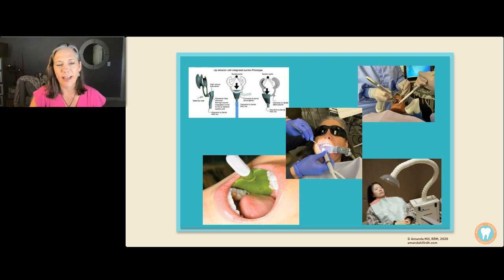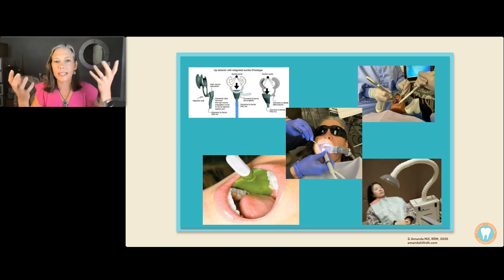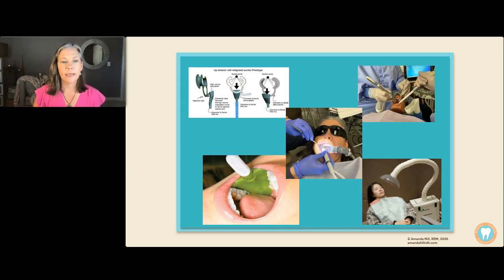We're going to fly through this fast, but they had a bunch of different setups. One of them is a prototype, and it's not on the market yet, but rumor has it the CAO group will be putting it out soon. That's in the upper left-hand corner. It sort of had a mouth opener that held your mouth open, and then something right below your chin that sucked in aerosols. In the upper right-hand corner, you see something called the Aerosol Away, which has 2 cups right by the person's face that suck in aerosols. In the center, you see Isovac or Isolite. In the lower left, you see the Relief. And in the lower right, you see the Vac Station, which is one of those external units. Okay, so we're going to see how they did.